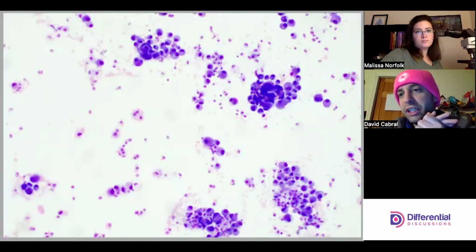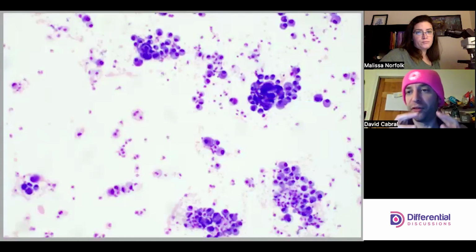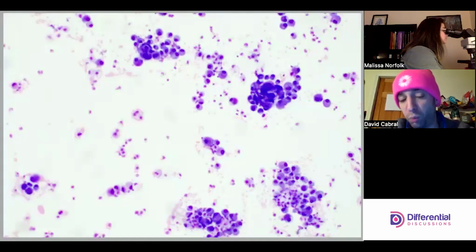Typically when we see mesothelial cells, they can be singular and they can be in sheets. These are tissue cells, so they should be continuous within the body. Normal physiology, they should be continuously layered with all the sister cells around them. When you start to see a three-dimensionality to it, there is a greater probability that it may be an abnormal malignant growth. If you get more of a blobby characteristic, that could be evidence of a tumor of some kind. So we are going to be vigilant when we start looking on higher mag.